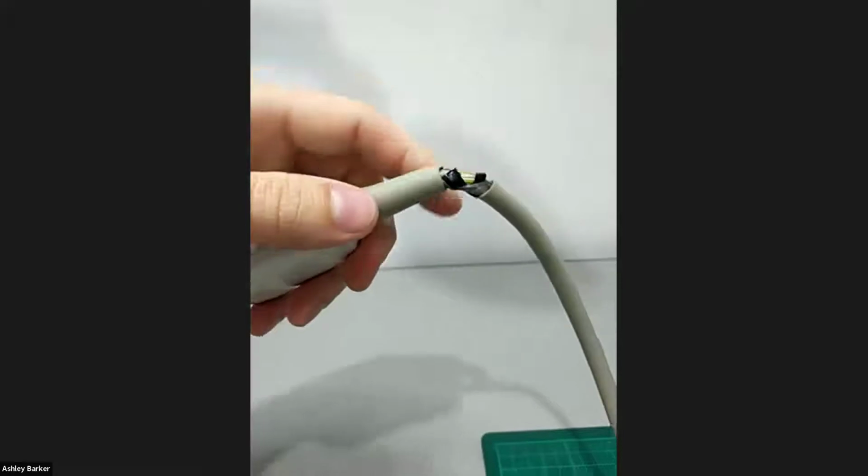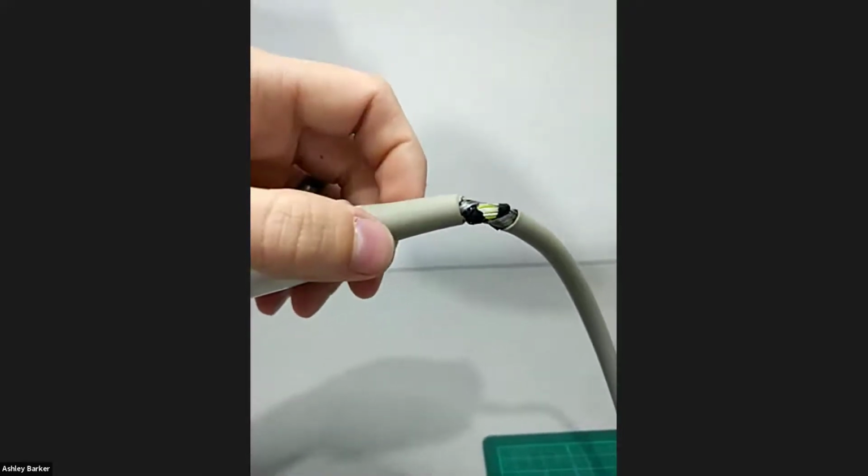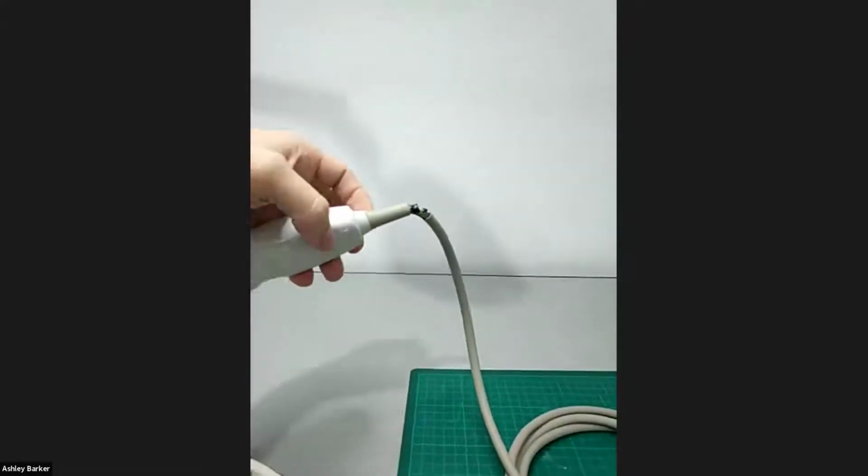But it's also common to see breaks like this, even when the strain relief is quite soft. It's just a common place for them to break.